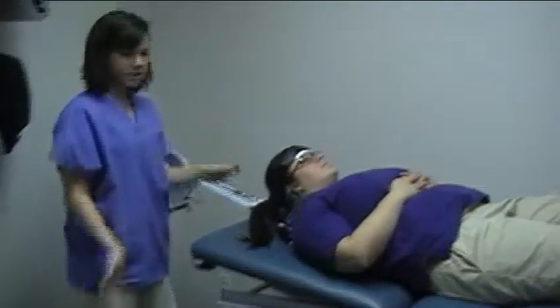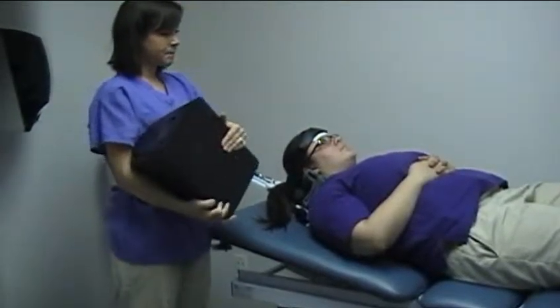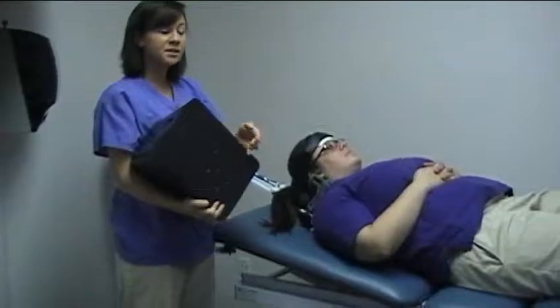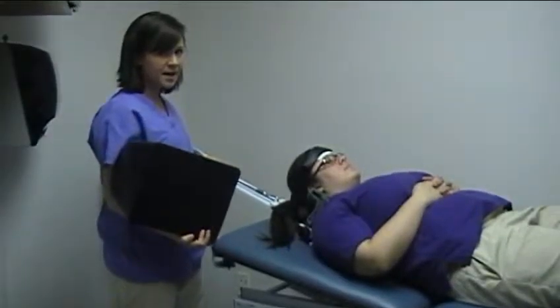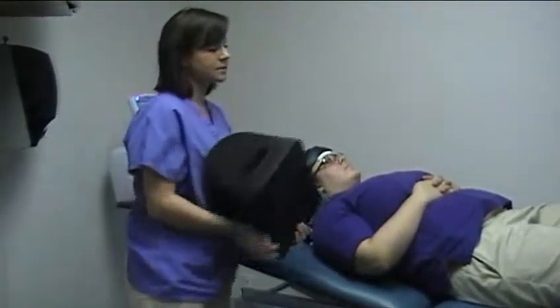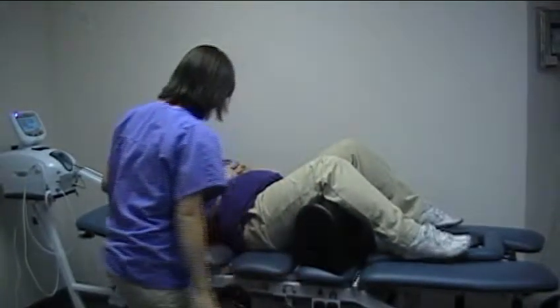Once they're all hooked up, this decompression therapy involves a lot of moving around to find the sweet spot on the patient. You may have to lift the table up and around and change the degree that the rope's at. It usually takes a lot of that adjustment. It's also best to put bolsters under their knees so they can just relax.